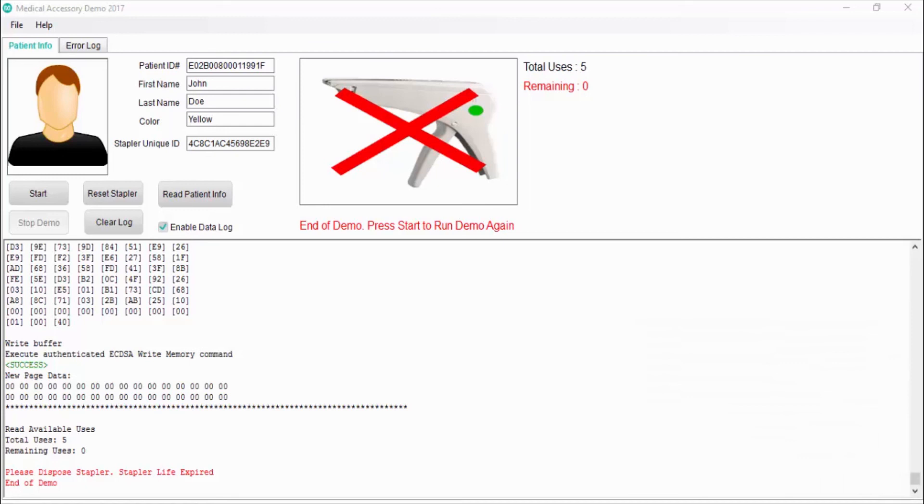After the two additional staples are used, the stapler has reached its maximum five-use life as configured for this demo. At this point, the stapler is electronically expired by a secure zero remaining staple count value. Since the medical accessory is at its limit, the software will not allow use of the stapler after the uses have been exhausted.